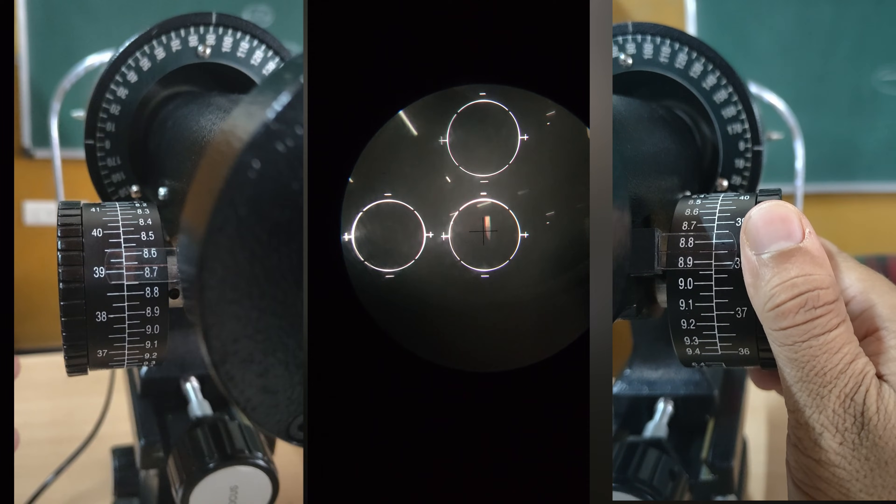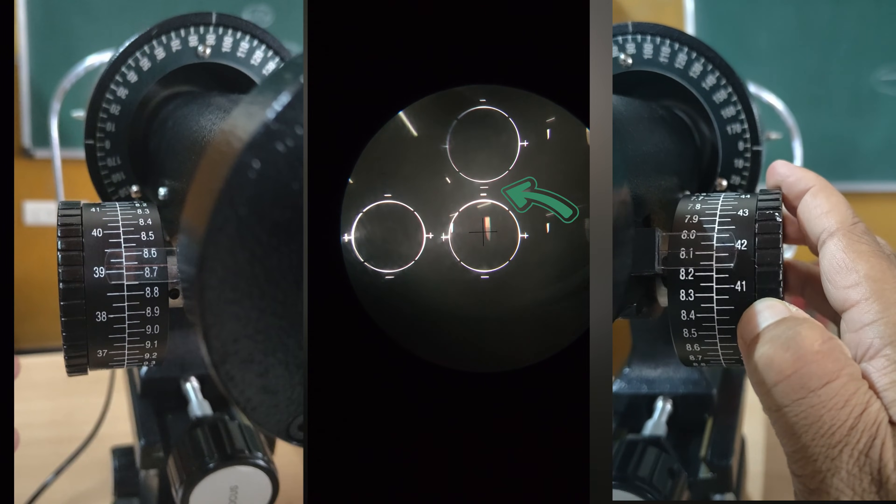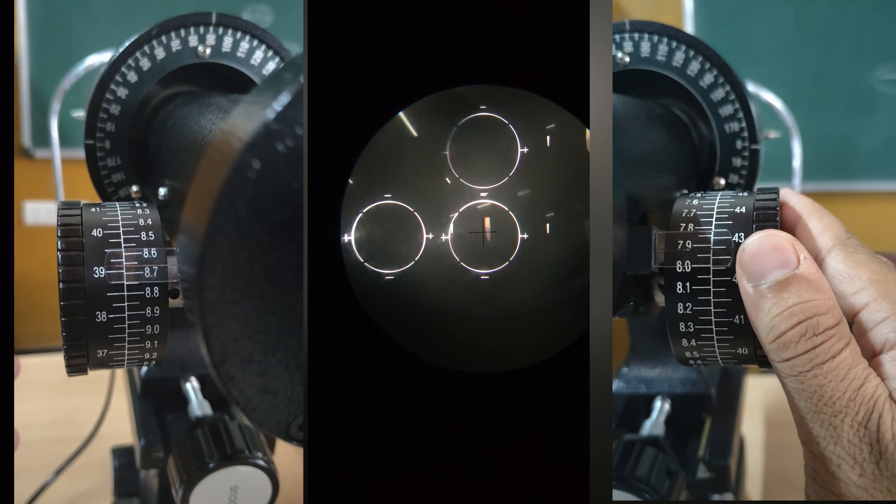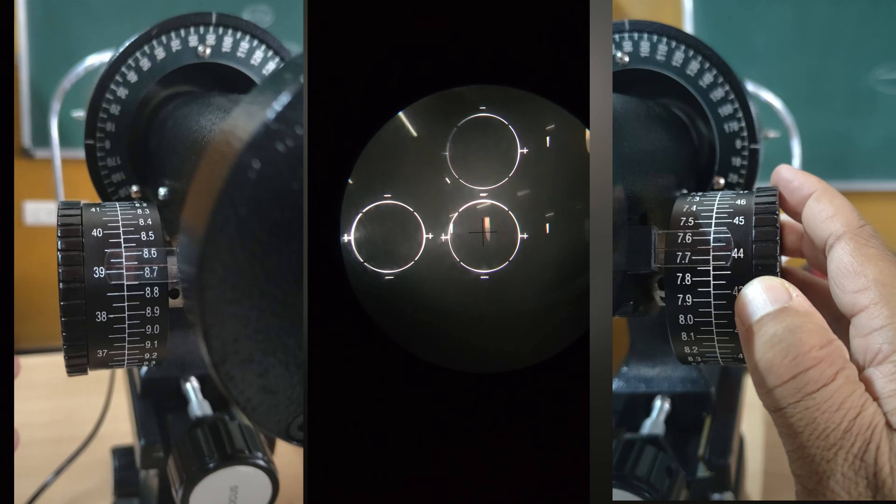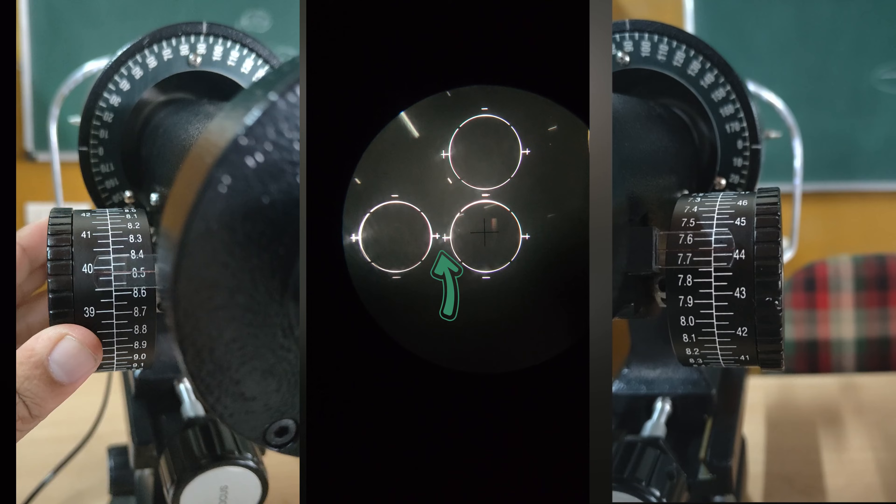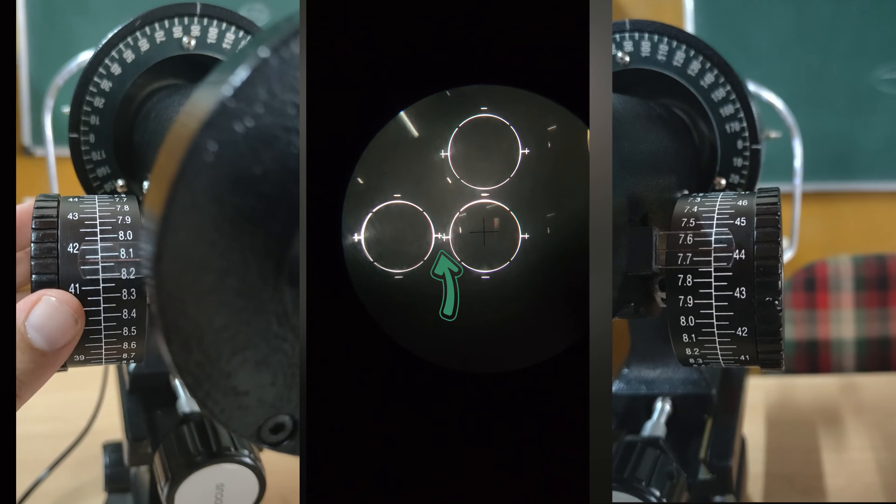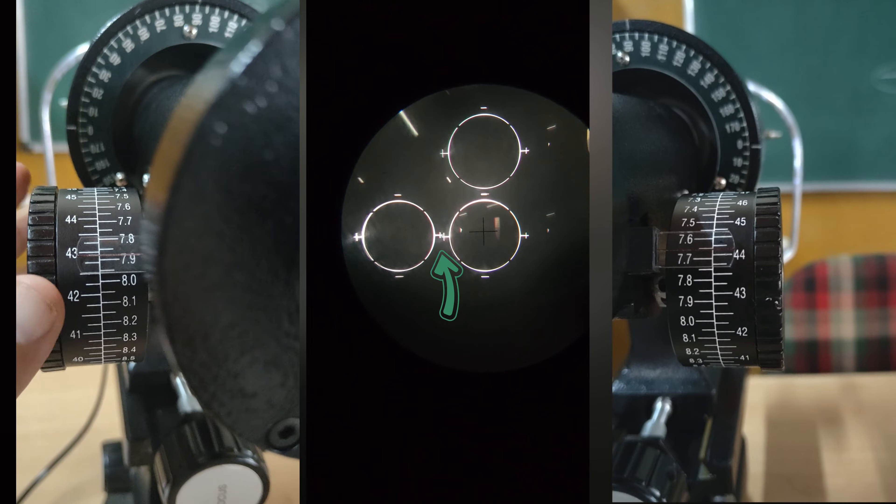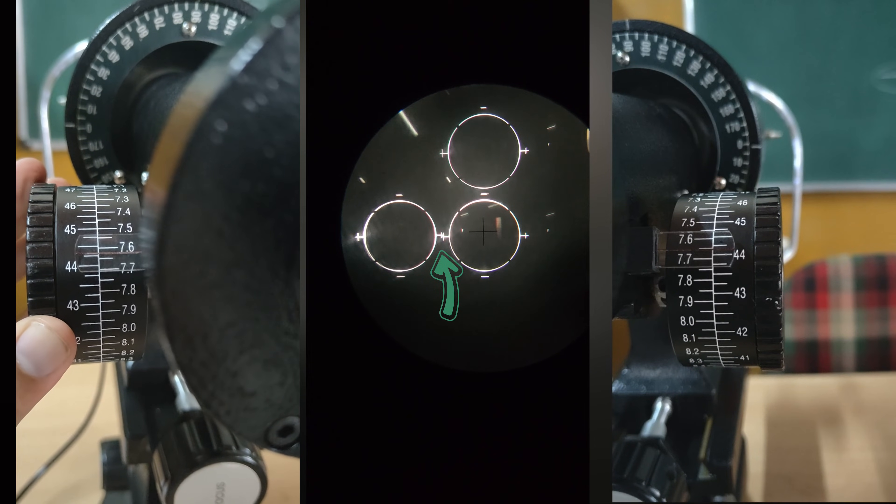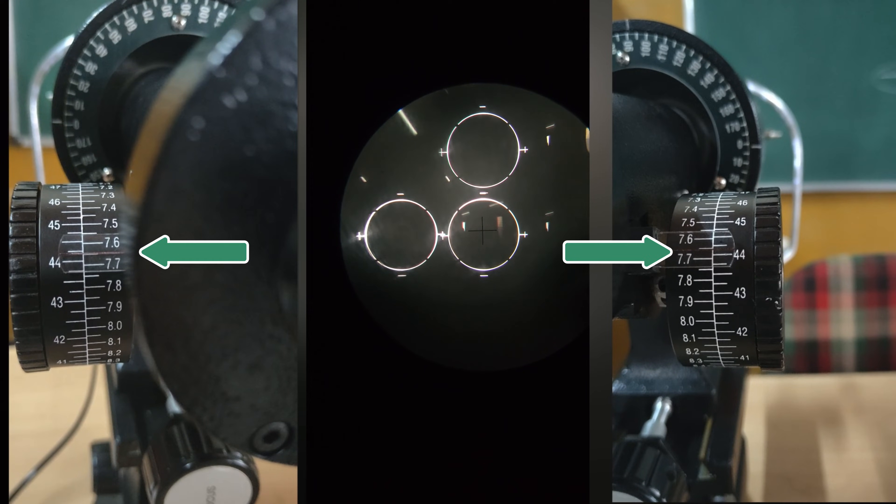Adjust the vertical wheel until the minus signs are overlapping. Adjust the horizontal wheel until the plus signs are overlapping. If it does, it means your instrument is calibrated.